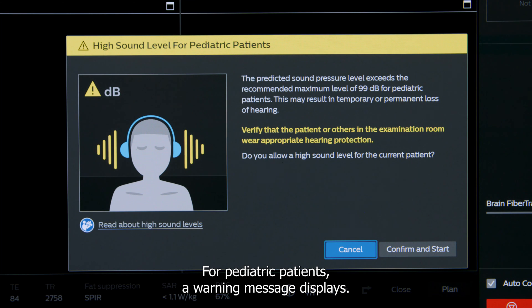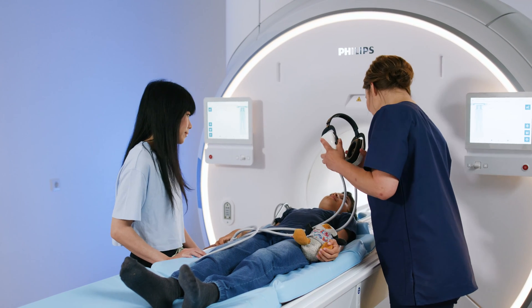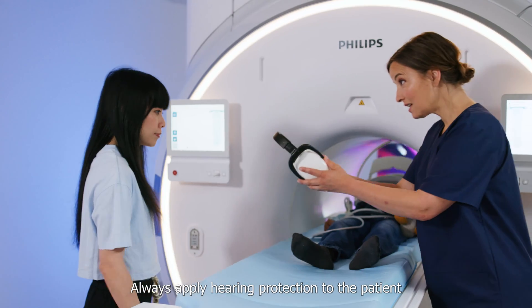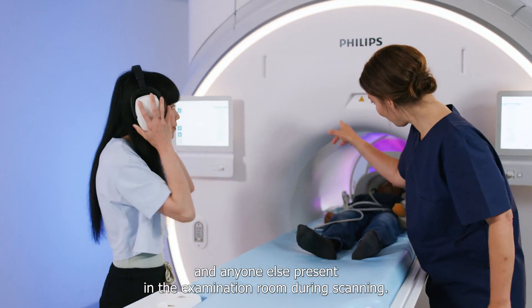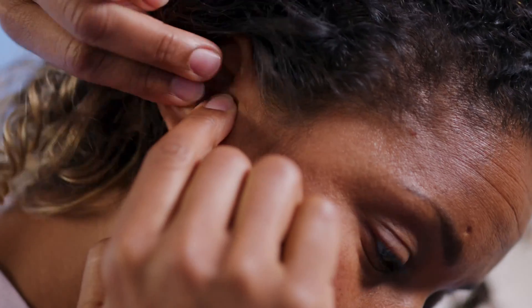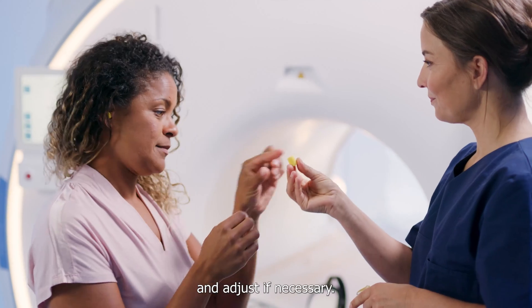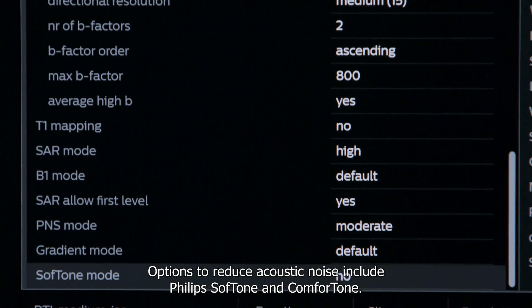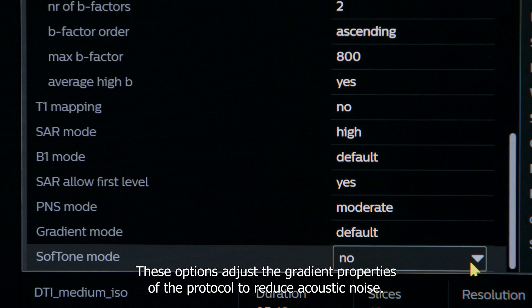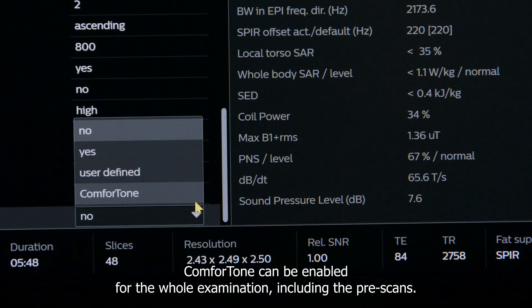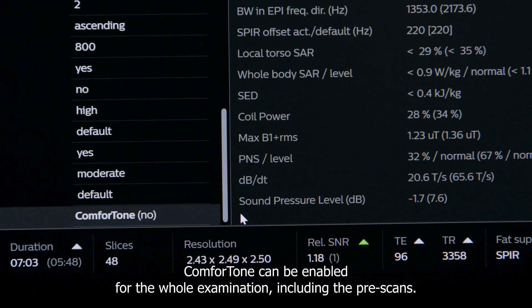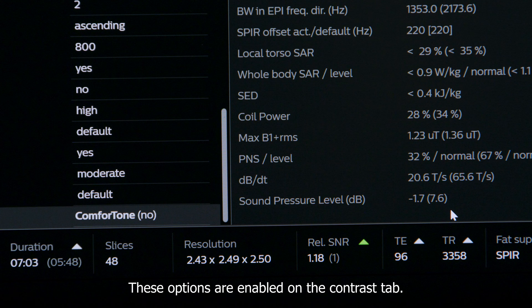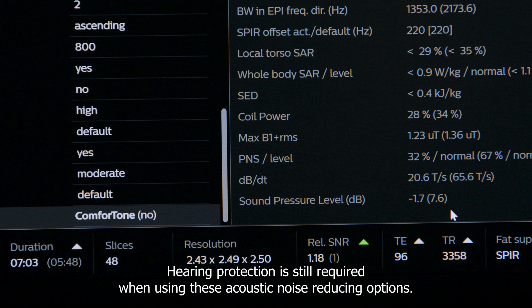For pediatric patients, a warning message displays. Always apply hearing protection to the patient and anyone else present in the examination room during scanning. After applying hearing protection, always check the fit and adjust if necessary. Options to reduce acoustic noise include Philips Soft Tone and Comfort Tone, which adjust the gradient properties of the protocol to reduce acoustic noise. Comfort Tone can be enabled for the whole examination including pre-scans; Soft Tone must be set per protocol. These options are enabled on the contrast tab. Hearing protection is still required when using these acoustic noise reducing options.